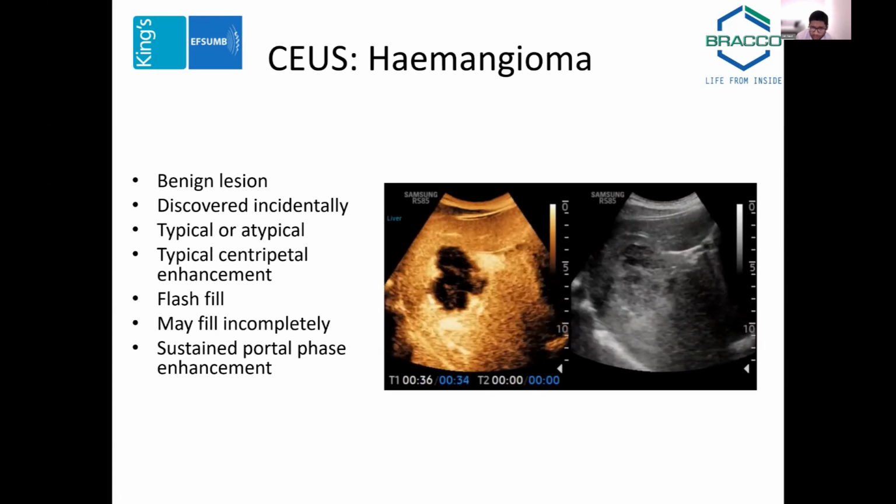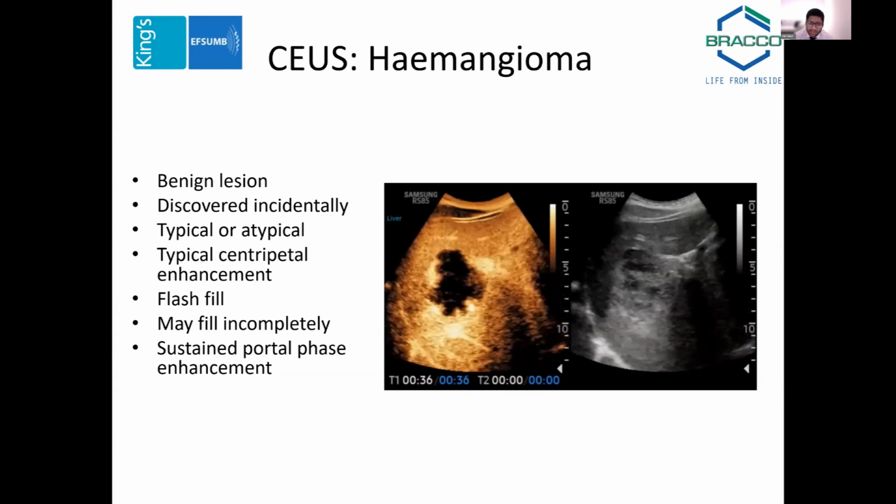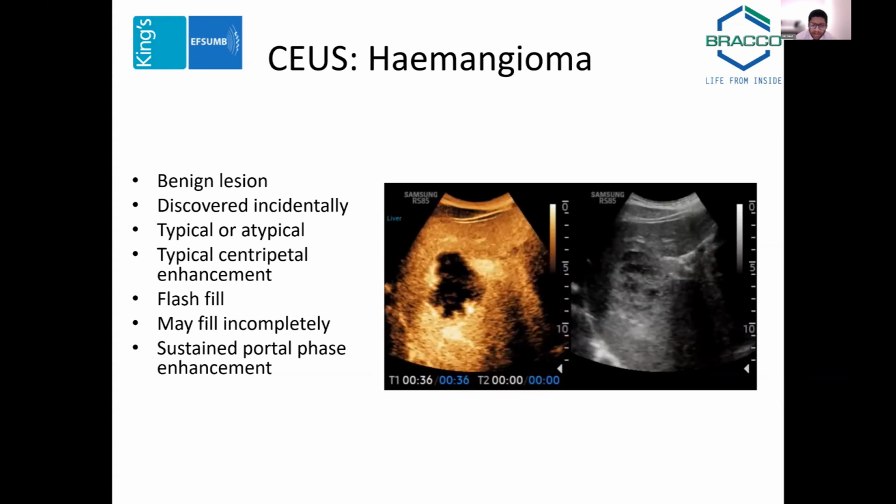They are small, subcapsular, adjacent to the hepatic veins, very hyperechoic, and they may have a through transmission as well. And even with the development of microvascular imaging, you may see some peripheral Doppler signal on the outside of some of them, but it's less likely. When you see these sorts of lesions, you don't need to do anything.